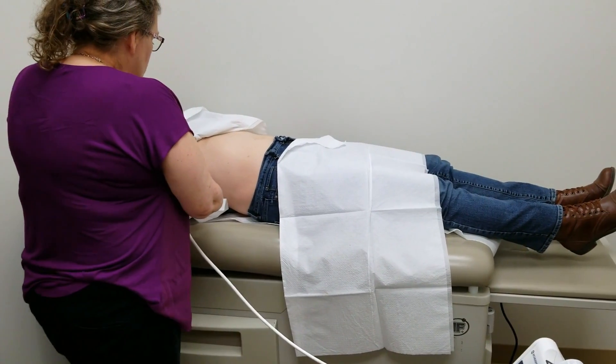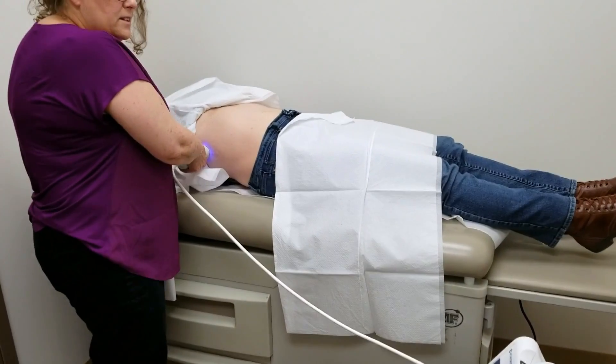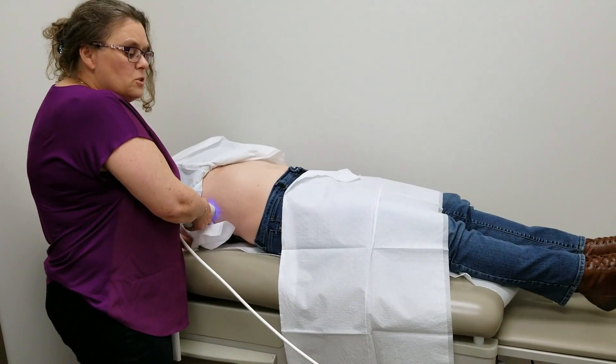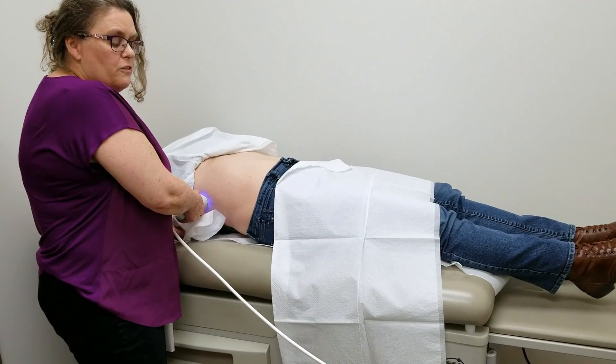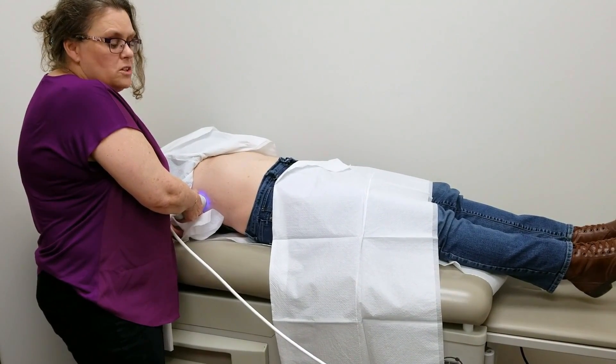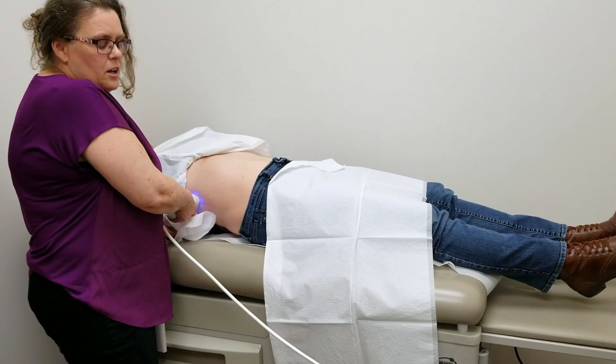I then locate a spot between the ribs, find it, and then the patient will feel a bit of a pulsation or vibration. That's really all they'll feel, and we do that about 10 times.